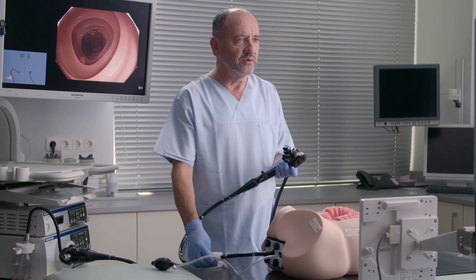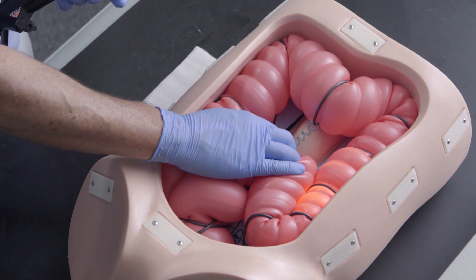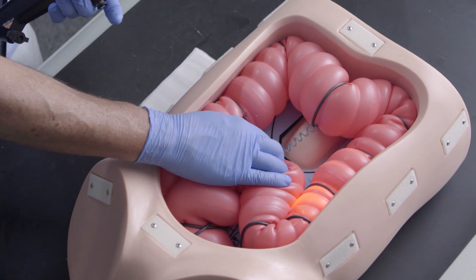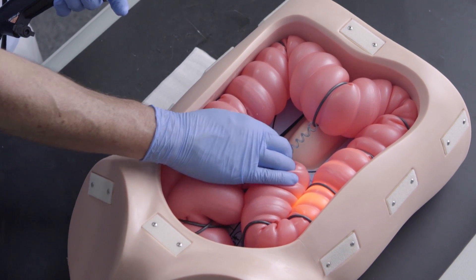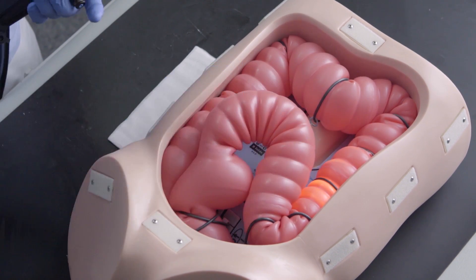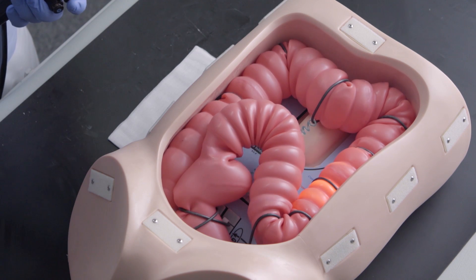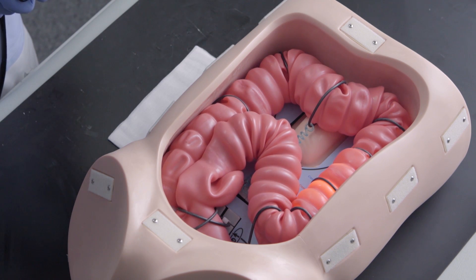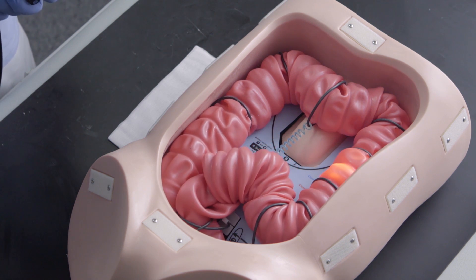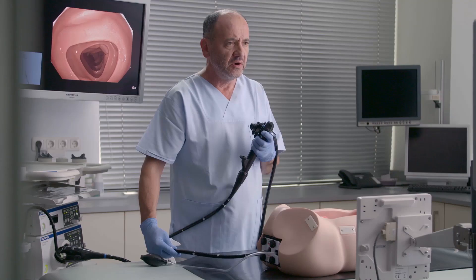You have a very nice view so that you can continue, but look at the sigmoid colon. Even if I try hard, I cannot pull it down. It's impossible because of the air and this confined cage, which is the abdomen. The only way to continue is to decrease the air if you get into this situation, so that you can really reduce this. Please take care of the air button.